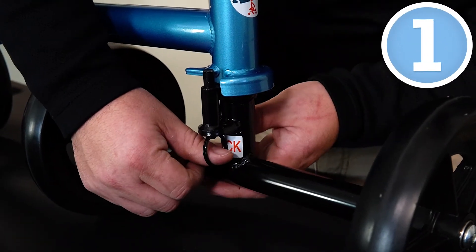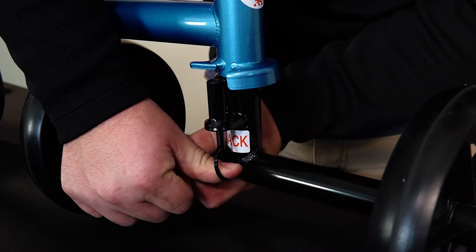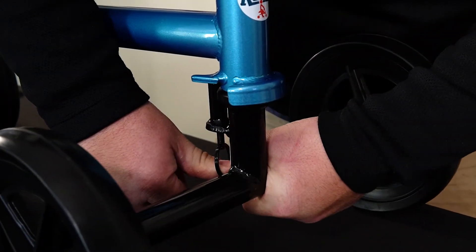what we're going to do is take this ring and pull it downward. Then you're just going to rotate those front wheels into position.